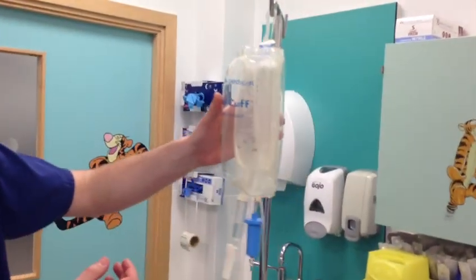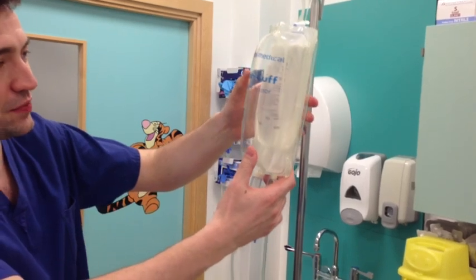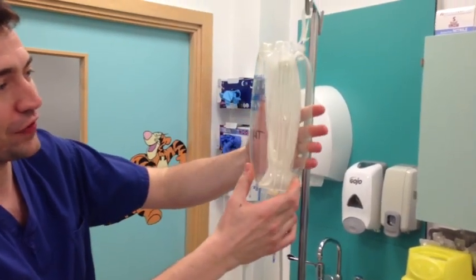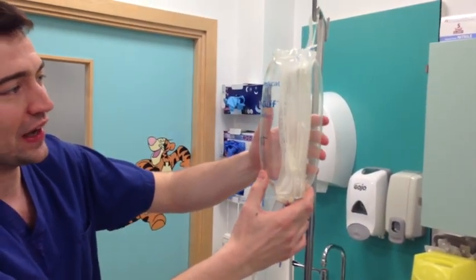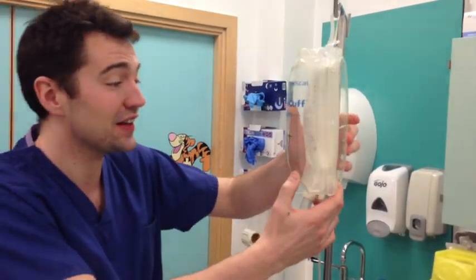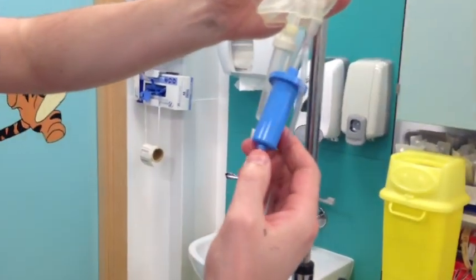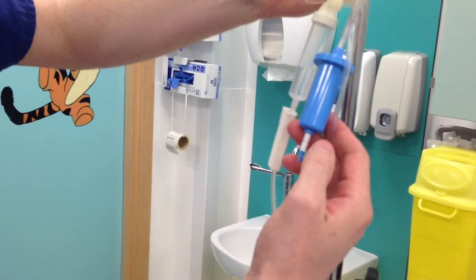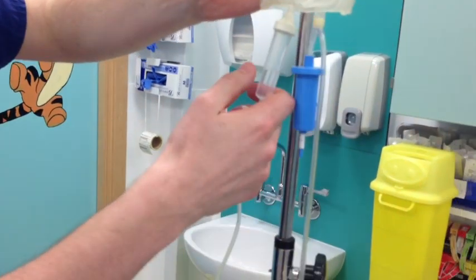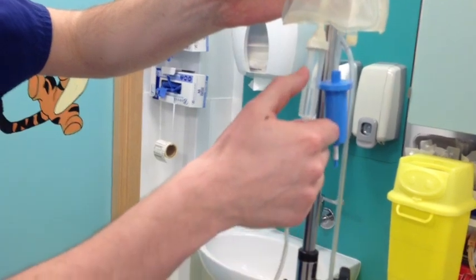Could you please check this piece of equipment for me? So from the pressure bag end down to the patient end, this is a standard pressure bag for a 500ml bag of fluid. It has normal saline, which is in date, clear, and looks intact. The pressure indicator shows it is adequately pressurised, and the chamber is adequately filled between a third and a half.